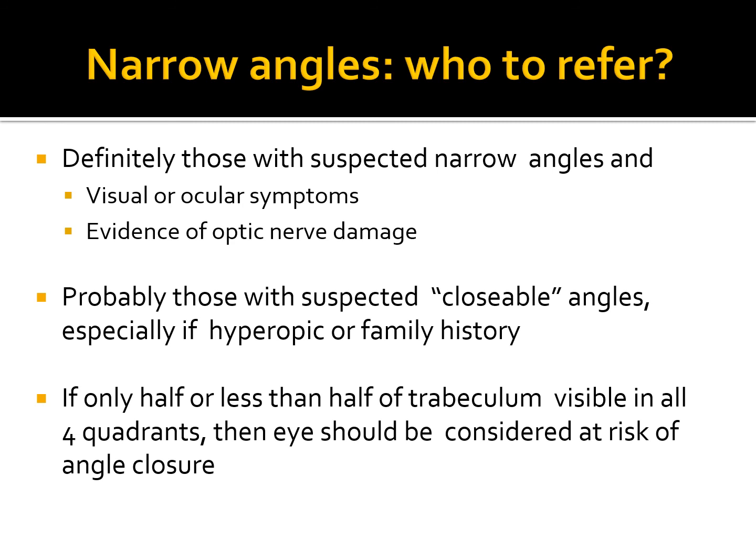So on the whole, my general consensus is I don't believe we need to use it. I think the faff and the risks of infection and so on are greater than the benefit we get from it. Also, it's not unusual for me to use provocative testing anyway. I'm not averse to that. And if I can create a provocative situation where I can induce an IOP spike, then that's evidence that the angle is closable as well.